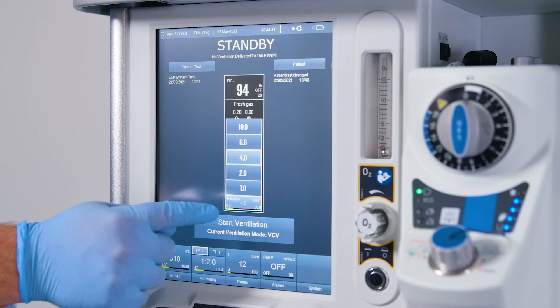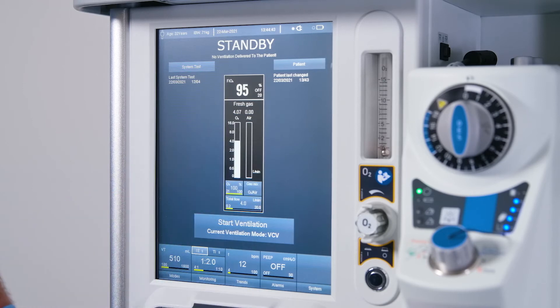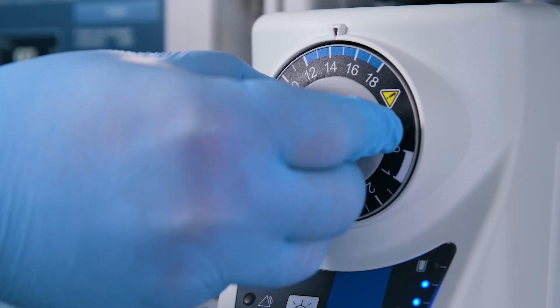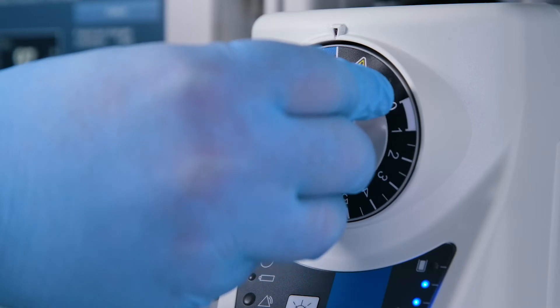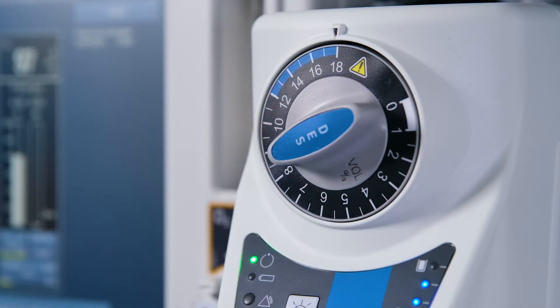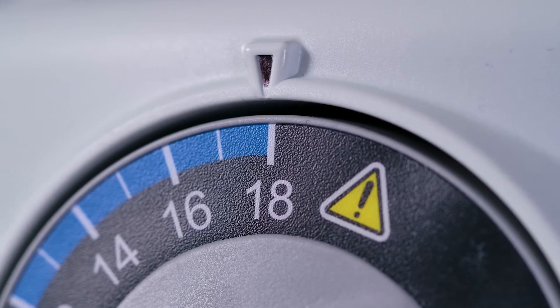Set a fresh gas flow of 4 litres per minute on the anesthetic machine. Set the concentration control dial to 18%. Purge the vaporizer for a minimum of 30 seconds.